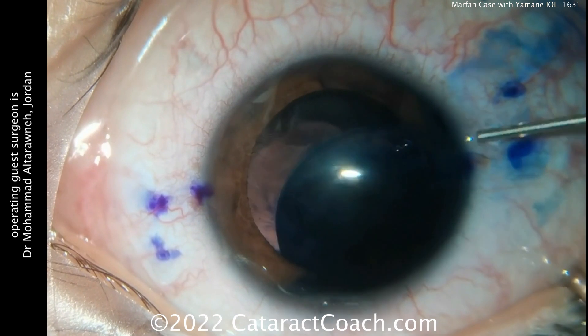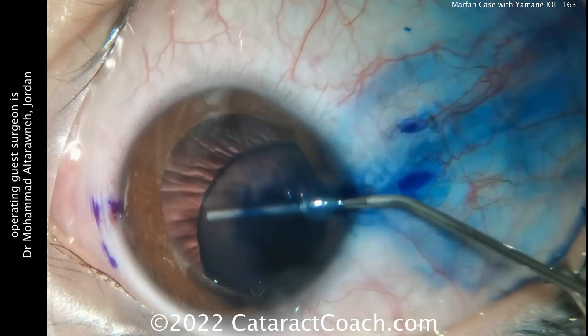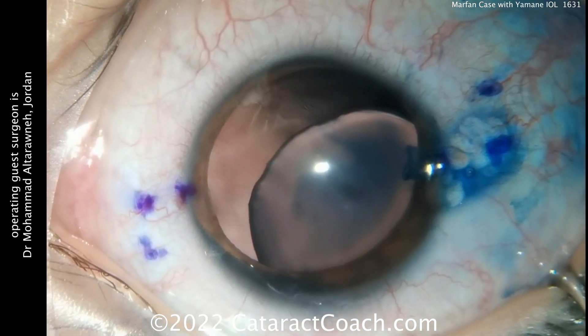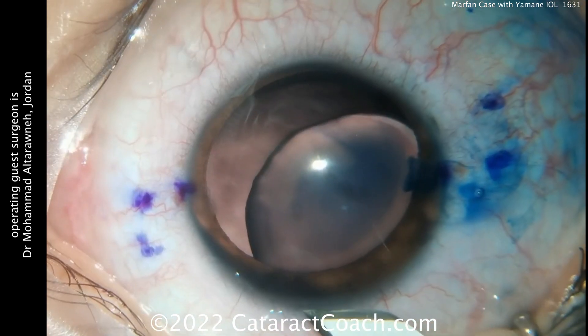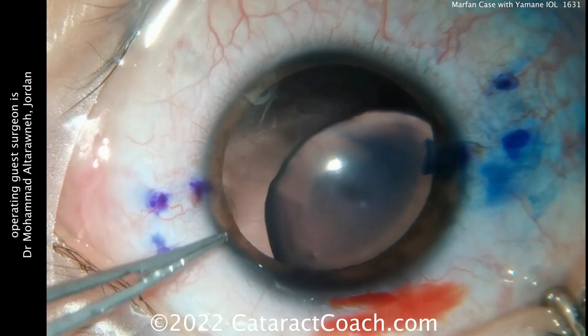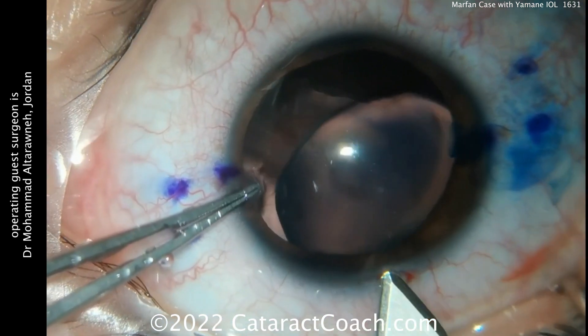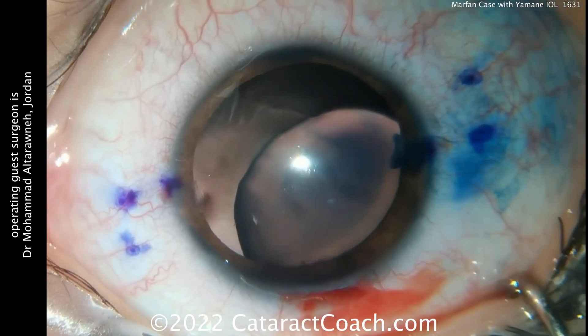Notice how just a little trypan blue dye is placed. You don't want to flood the anterior chamber, because if you do that, the trypan will go back into the vitreous cavity and block your red reflex — you don't want that. Now making the main incision here. I like the nicking of the limbal vessels, because in this younger patient you definitely want this incision to seal well.